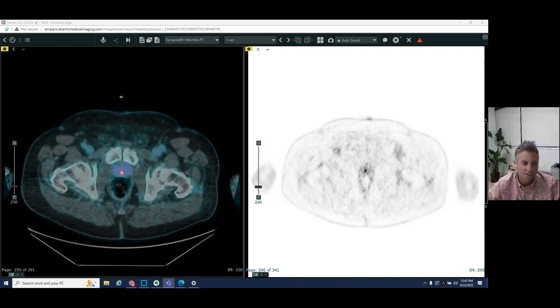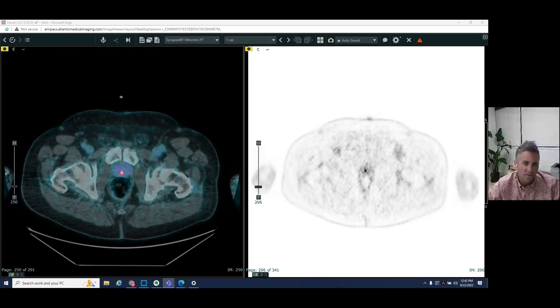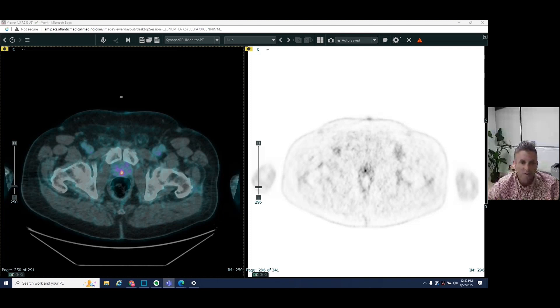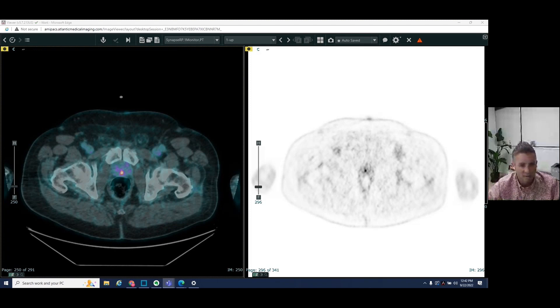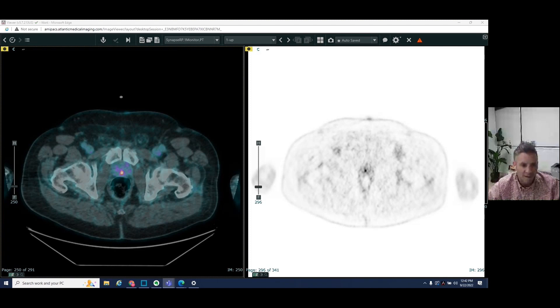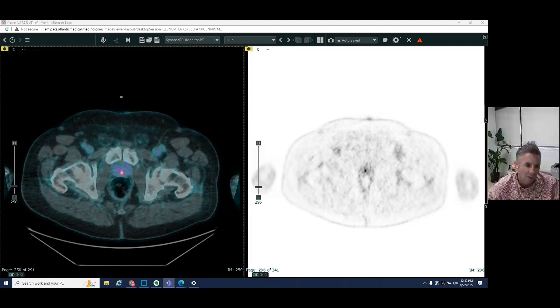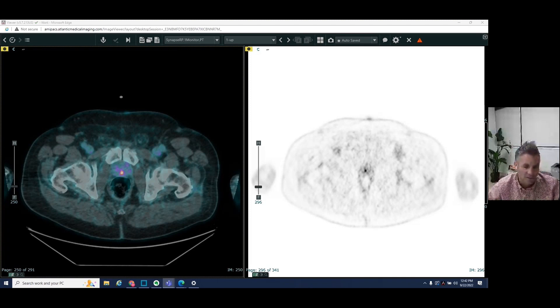So this is a patient who had prostate cancer, had a prostatectomy seven years ago, had chemotherapy and radiation therapy, and presented with an elevated PSA level, which is a lab value that urologists and oncologists use to measure whether there's a recurrence of prostate cancer.